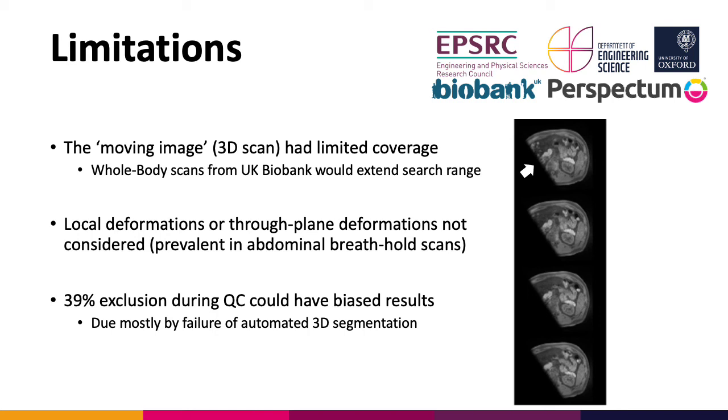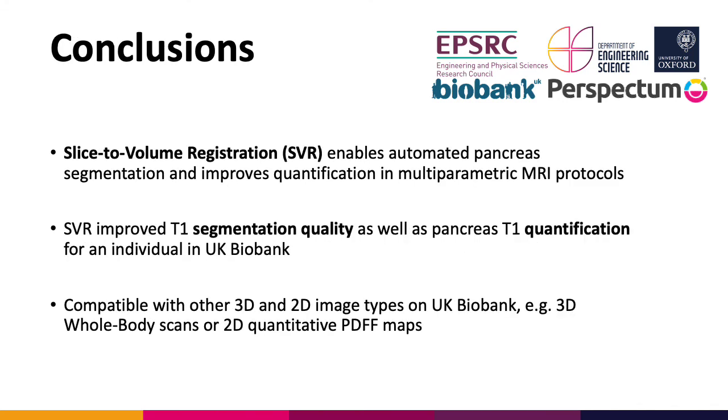The performance of our method using affine and rigid alignments encourages more advanced approaches. Also, the 39% exclusion during QC could have biased the results, though this was due mostly to failure of the upstream segmentation method. In conclusion, slice-to-volume registration enables automated pancreas segmentation and improves quantification in multiparametric MRI protocols.